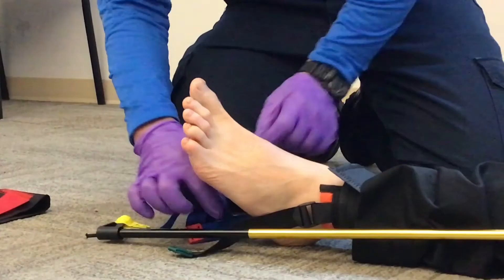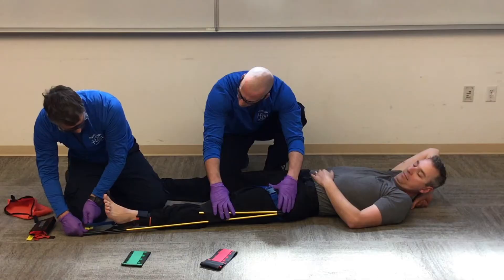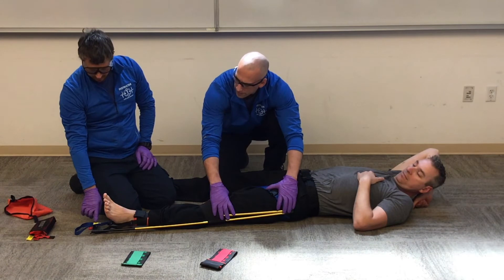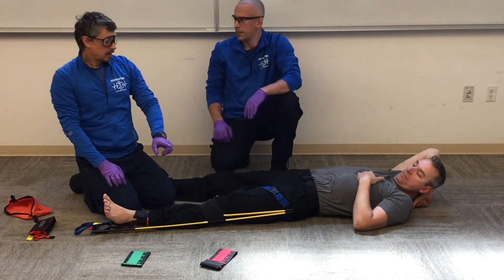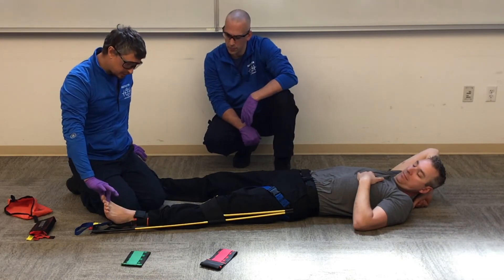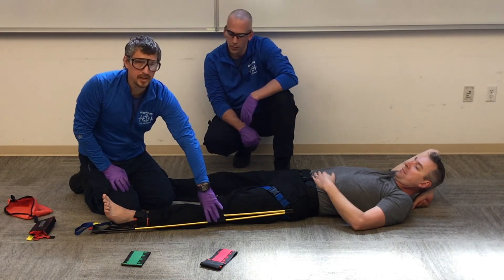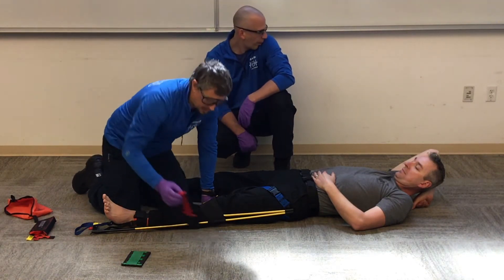Once I have that secure, I'm going to pull on my red tab. As I pull on my red tab, I'll push on the device — push up and pull down — that's going to pull my traction. Because the KTD does not have a scale on it, I can't pull 10 or 15 pounds; I don't know where that is. So I can pull until the injured extremity is the same length as the good extremity, or until my patient feels relief. I can also have my partner release manual stabilization once my traction splint has taken over that traction.